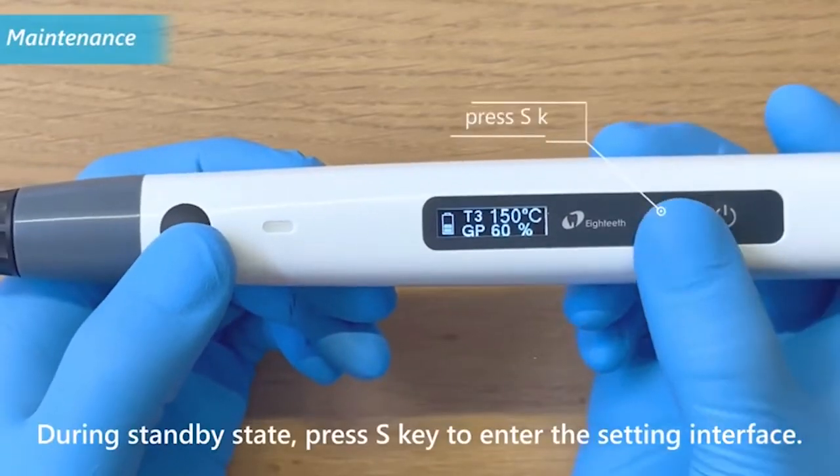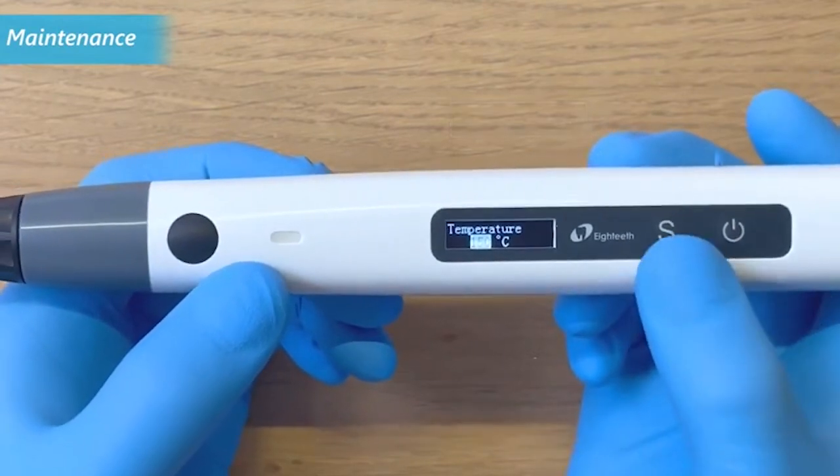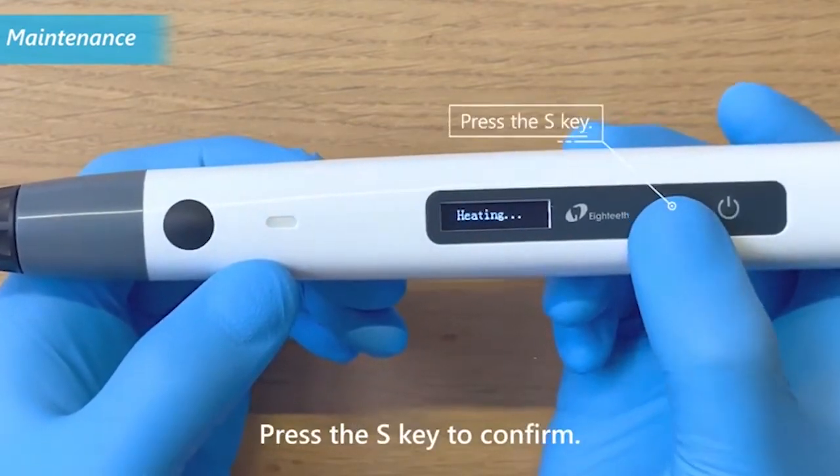During standby state, press the S key to enter the setting interface. Press the S key until the change GP interface appears. Press the main switch to select yes, then press the S key to confirm.